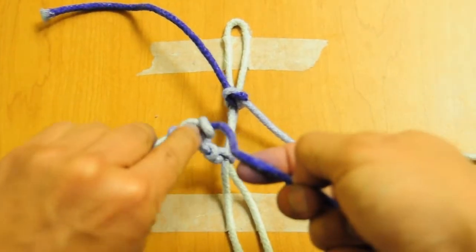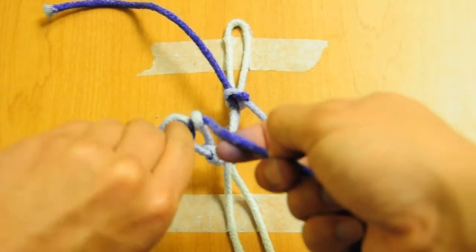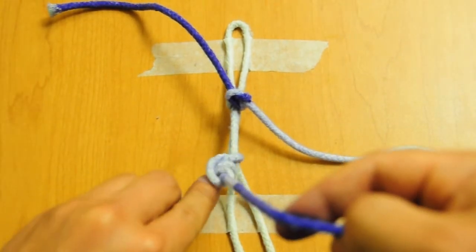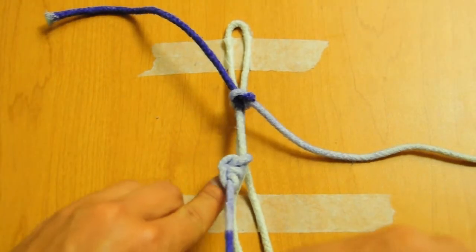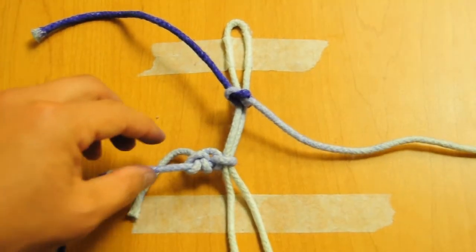Back to the index finger, running out of suture here. A lot of tension here. And you can see the difference between these two knots.